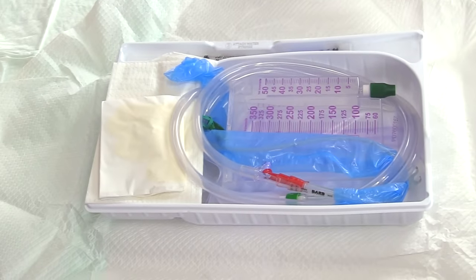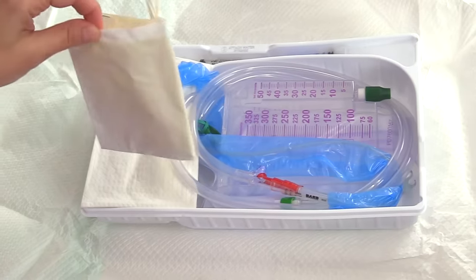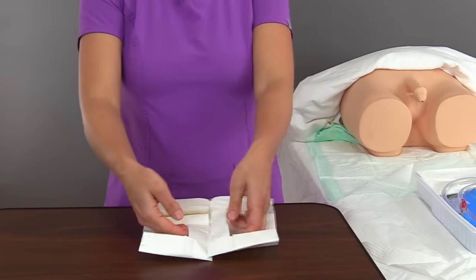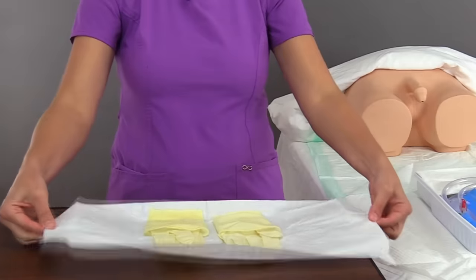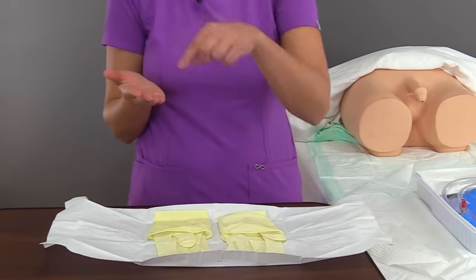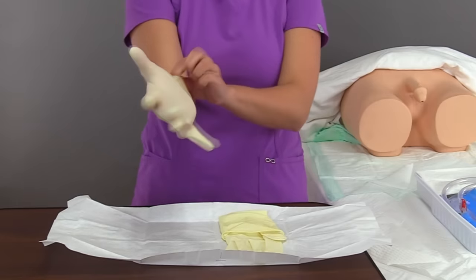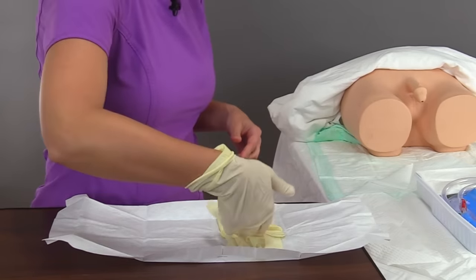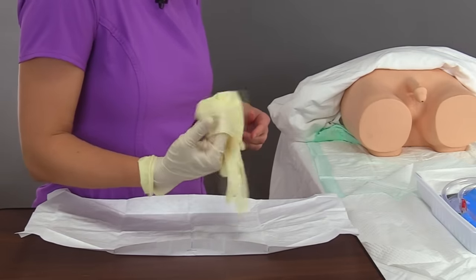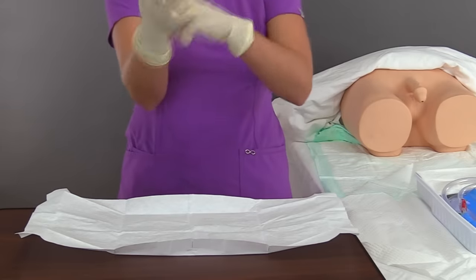The first thing to grab from your kit are the sterile gloves. Place them on a clean surface, open the packaging using the tabs so your fingers can go under them. Glove your dominant hand first by grabbing the inside cuff, then use the sterile dominant hand to go under the cuff of the non-dominant glove. Glove that hand and adjust both gloves.